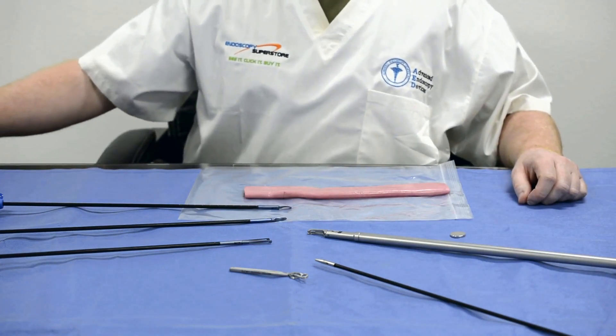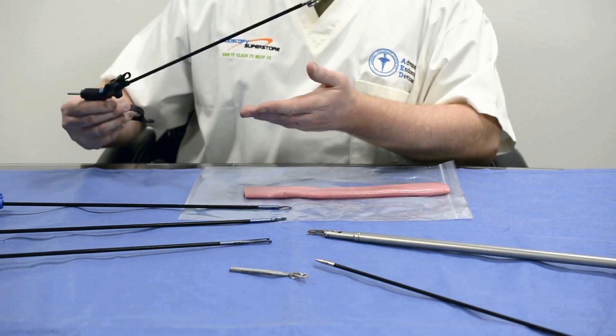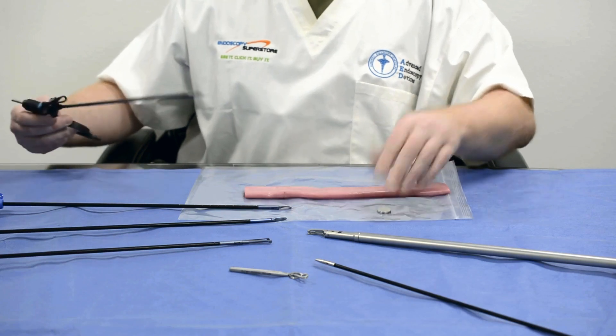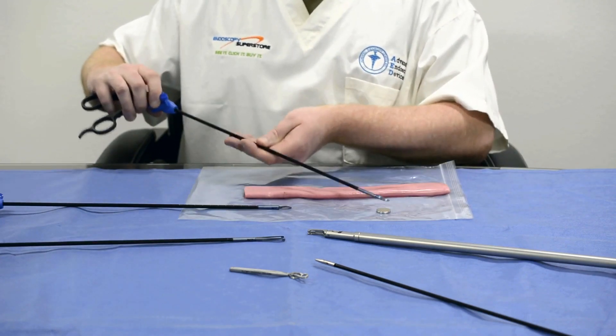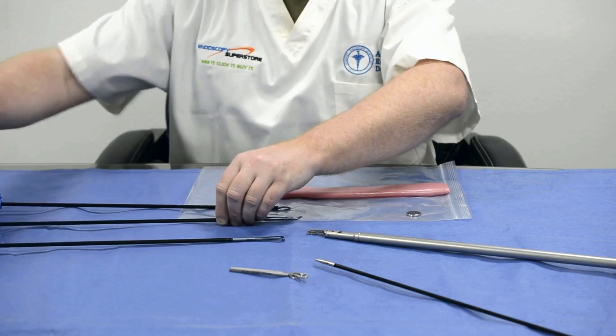These instruments are made of titanium and do not attract any magnets. Traditional instrumentation in the market will grab the magnet and bring it with it, making it difficult to place and manipulate. Our titanium instruments do not have the same effect — you can manipulate the magnet and it will stay exactly where you place it.